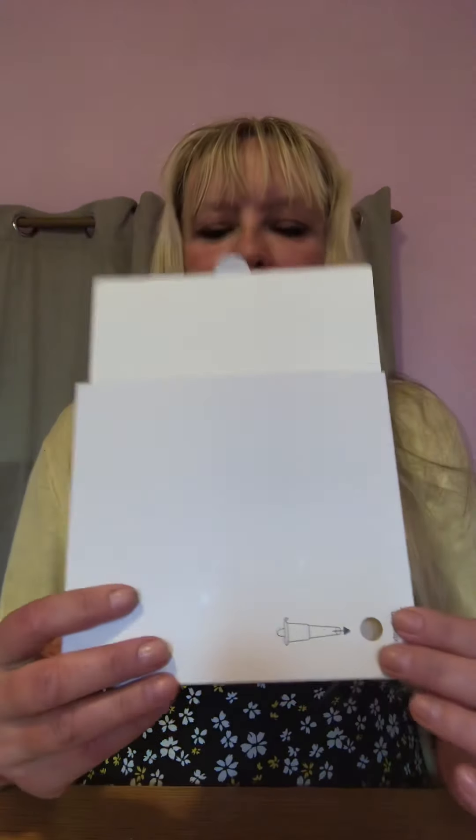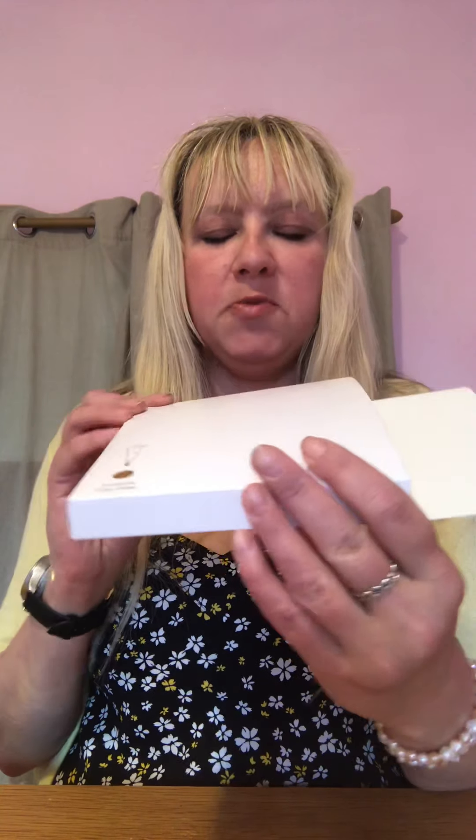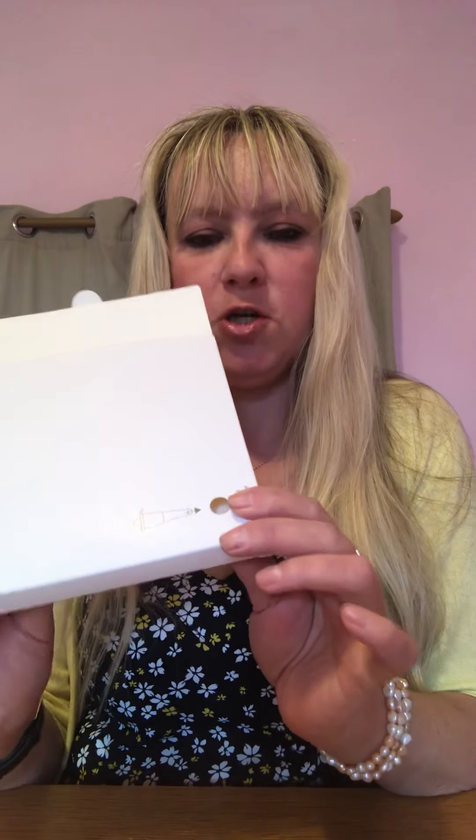One of the biggest parts of the lateral flow test is the extraction tube holder. I'll just show it here for those that can see — this is a big piece of card, a box shape to it. On the top layer of the box is a little hole, probably about a centimetre in diameter, just big enough for the tip of your little finger. That is the hole in which you'd stand your extraction tube during the test process. Please don't think it's just an extra bit of card for recycling — that is a valuable piece of the test kit.